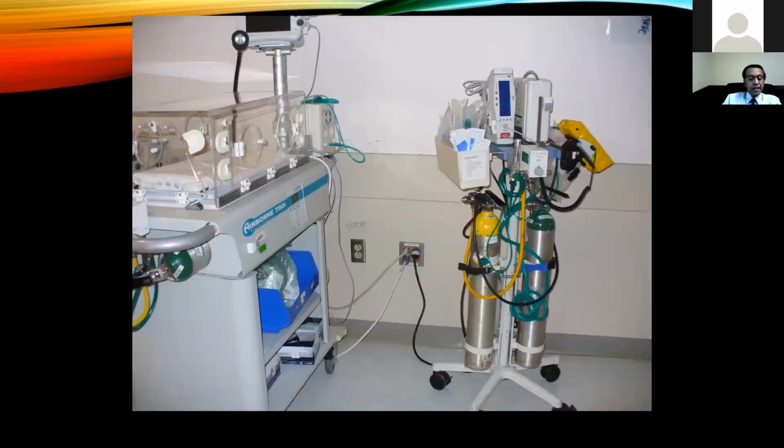That is the reason some of the neonatology units have already started using capnography during neonatal resuscitation, and also continuously monitoring ventilation in the neonatal ICUs.